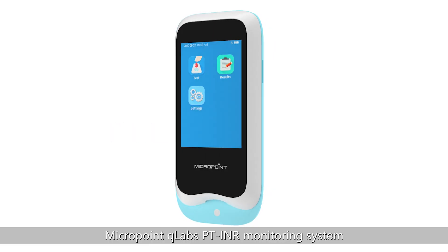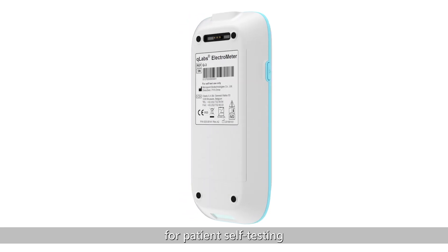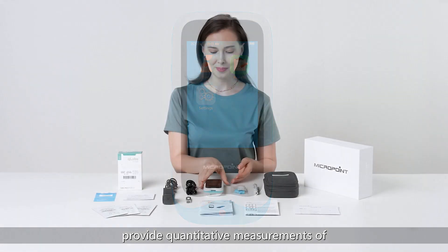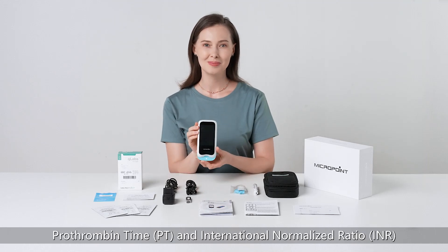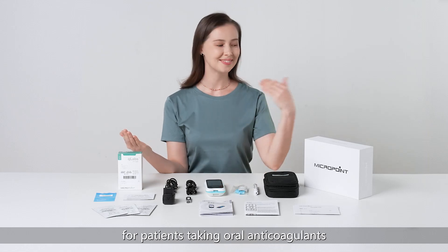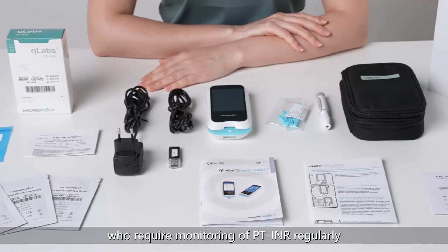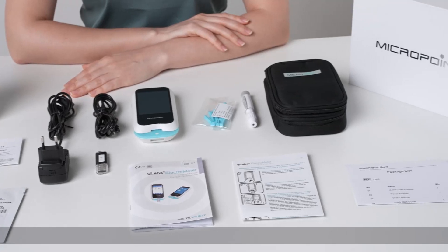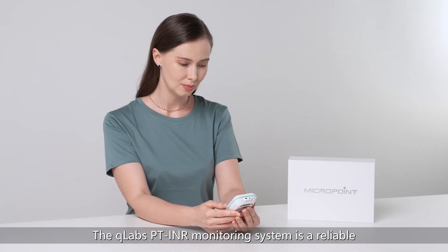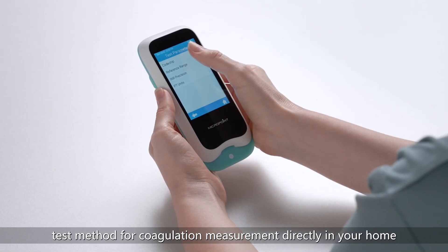Thank you for choosing the MicroPoint Q-Labs PT-INR Monitoring System for patient self-testing. The Q-Labs is designed to provide quantitative measurements of prothrombin time and international normalized ratio in fresh capillary whole blood for patients taking oral anticoagulants who require monitoring of PT-INR regularly. The Q-Labs PT-INR Monitoring System is a reliable, quick test method for coagulation measurement directly in your home.